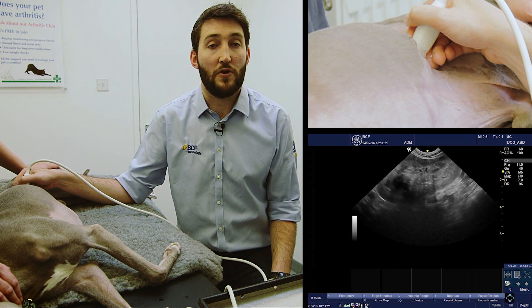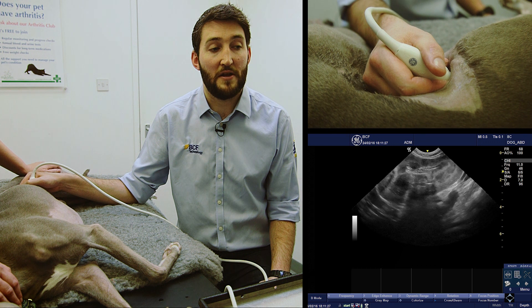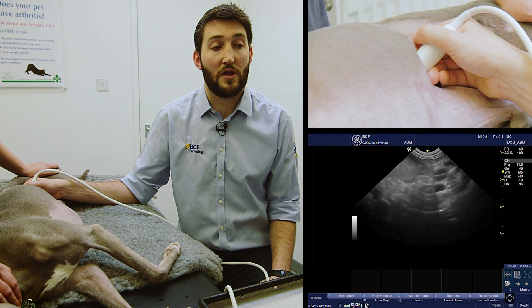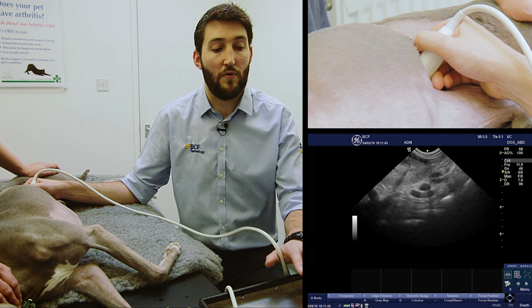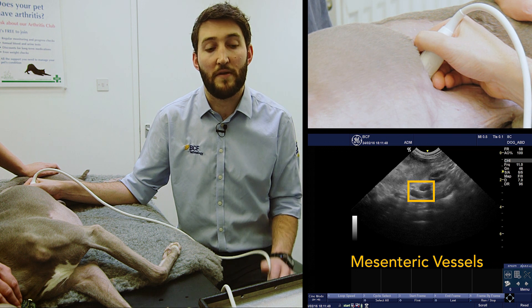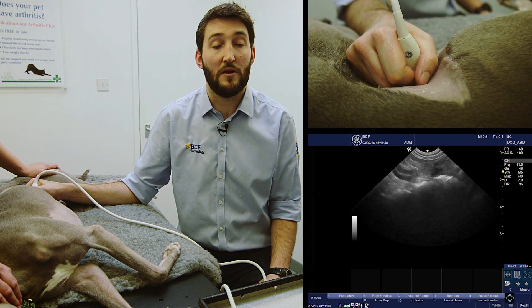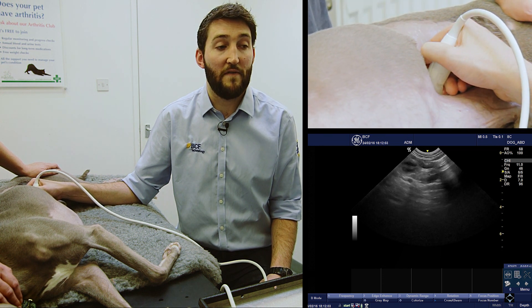Once you've found the left kidney in longitudinal plane, we're going to physically slide the probe down the body wall ventrally, just off the ventral border of the left kidney. As we do that, the kidney comes off the screen and we're now into the root of the mesentery. You can see just below these loops of small intestine a mesenteric blood vessel creeping into the screen, and with a little fanning we can see another mesenteric vessel just below a loop of intestine where a peristaltic wave is passing.